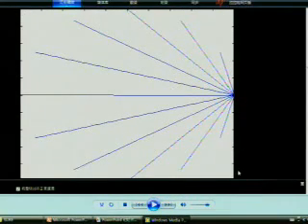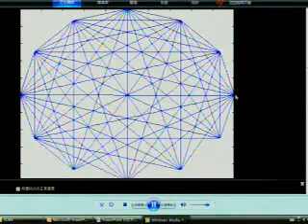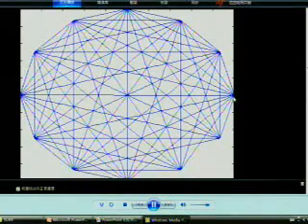So this one shows from the first transmitter, it emits a sound wave to all the receivers. And then from the second transmitter to all the receivers, from the third one to all the receivers, and so on. The way the time data is stored is that the first row of the time data matrix contains the time of those paths that come out from the first transmitter, and the second row of the matrix contains the time of those paths that come out from the second transmitter, and so on. But this is not what we want. So we need to do interpolation. We need to do manipulation.